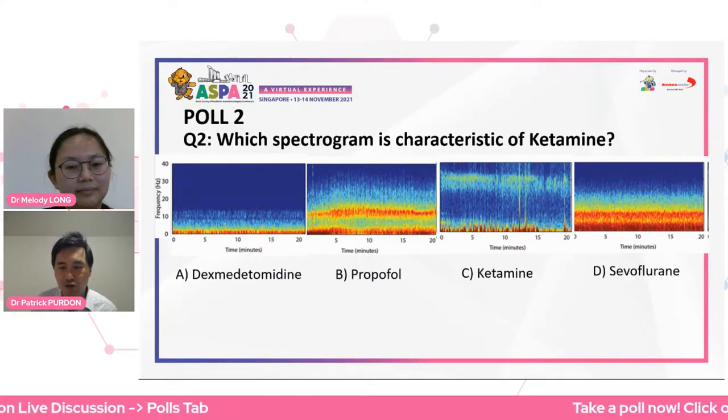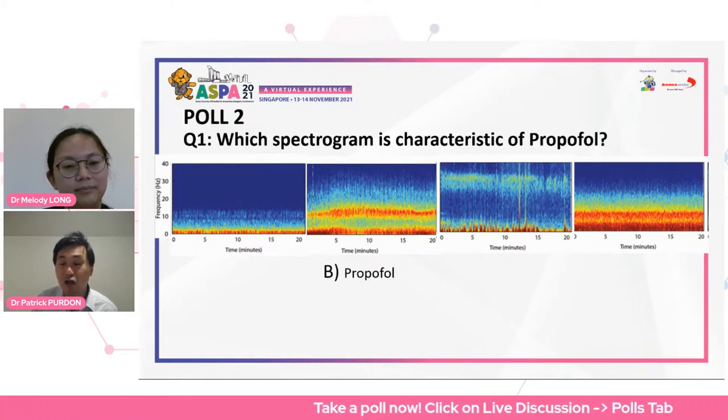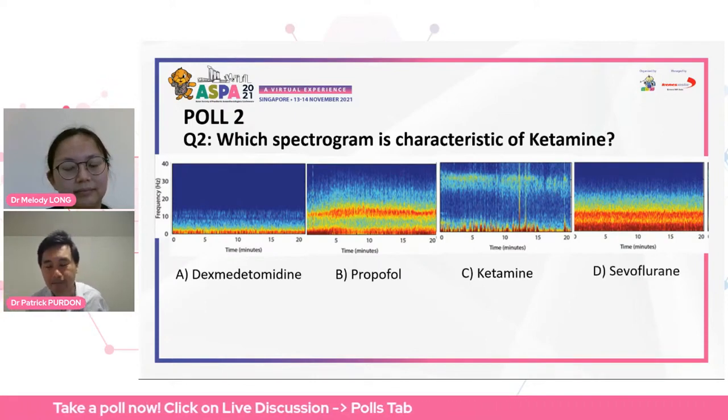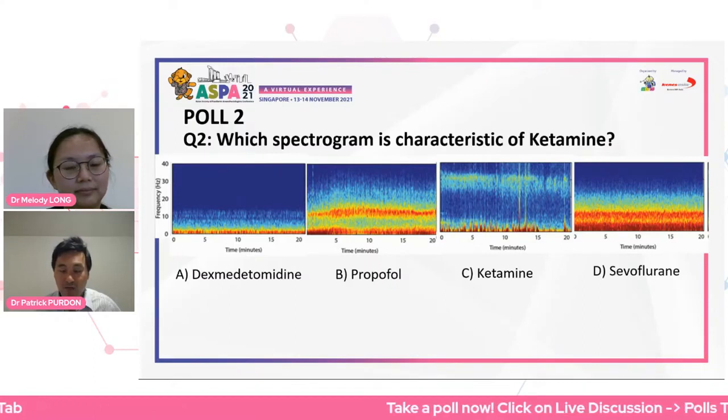So the first question was which one was propofol, and a lot of people chose sevoflurane. Now go ahead and leave them up. It's fine. Yeah, put the answers up. Thanks. Yeah, a lot of people chose D as the spectrogram for propofol, and you weren't that wrong actually.